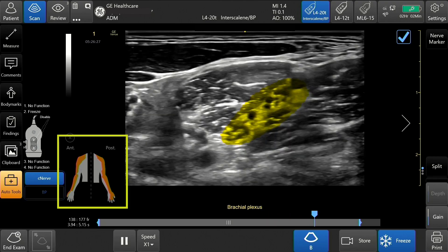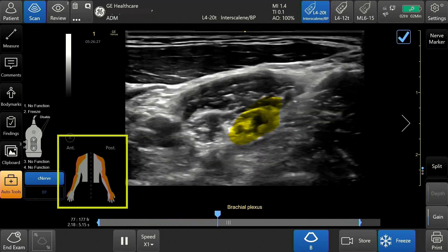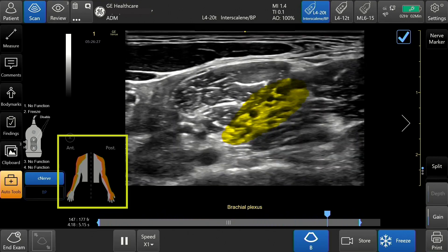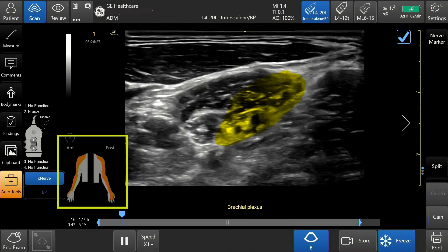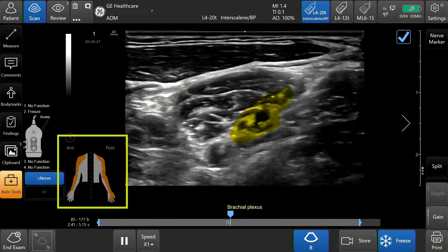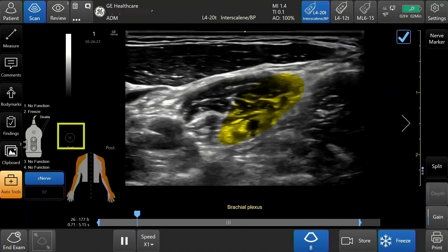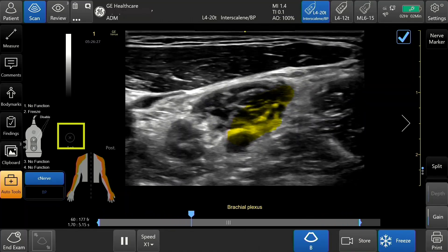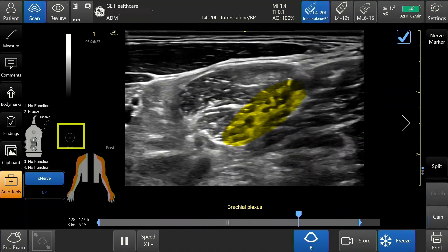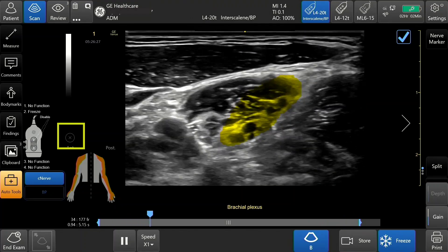C-Nerve displays a distribution map with orange highlighted anterior and posterior anatomy corresponding to the selected nerve block. The distribution map can be hidden by tapping the minimize button at the top left corner of the diagram.